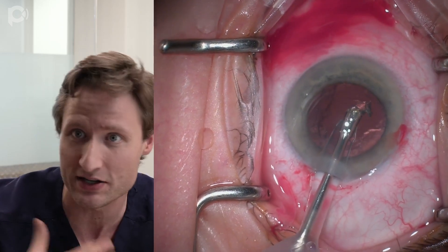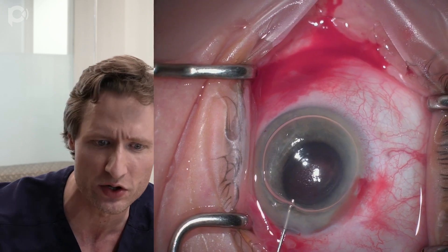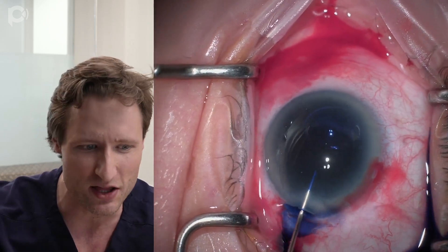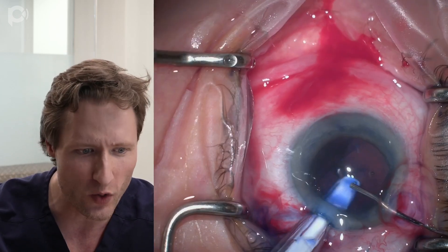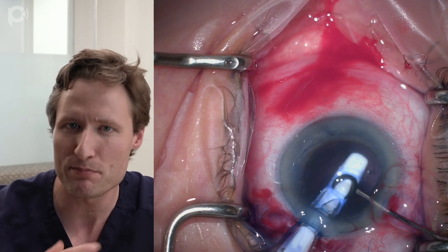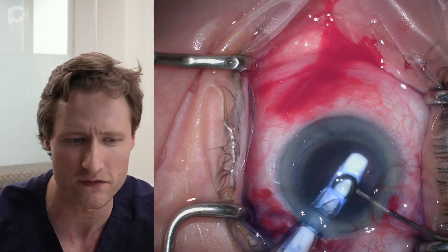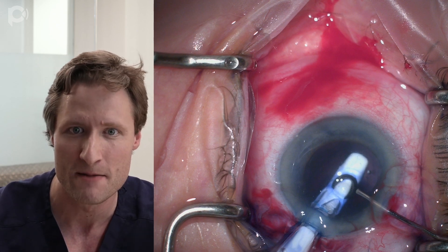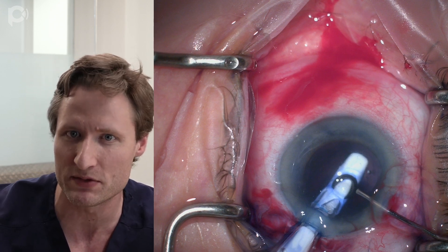The phaco goes uneventfully. I like to use a pre-chopper with a one-handed technique for a little more chamber stability. I put air in the eye, stain the back of the cornea with trypan blue, then put more viscoelastic in. Next, I put the lens inside the eye. My preferred lens is a three-piece silicone lens — the LI-61AO made by B&L. I have no financial interest, but I find it a very versatile and stable lens.